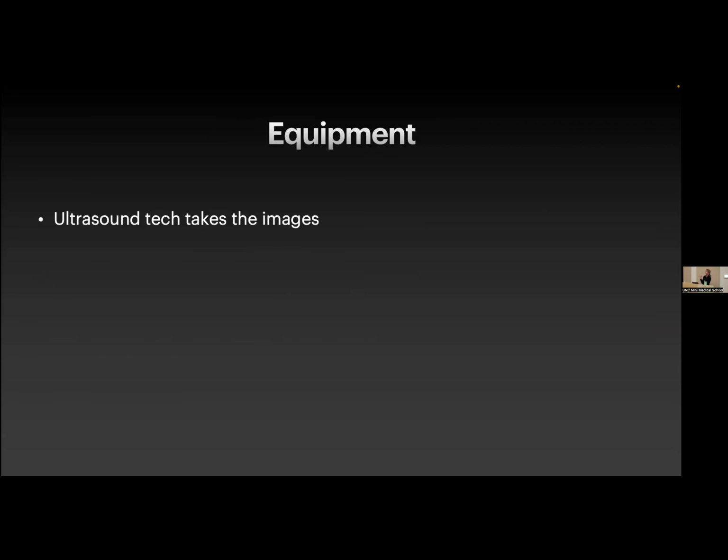The ultrasound techs will take the images, and oftentimes if the radiologist is in the same department, they'll come back and ask us, I have these images, is this enough? Or I see something, I'm not sure what it is, can you tell me, or come in with me and scan, and we scan together. So the tech is really wonderful to help us get the best possible images so that we can make the diagnosis. They are extremely important individuals.